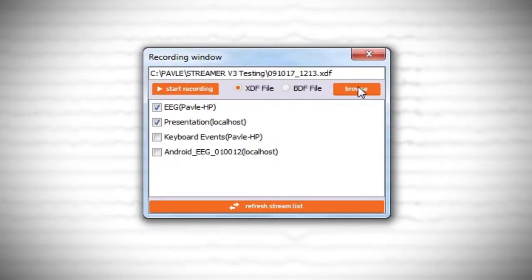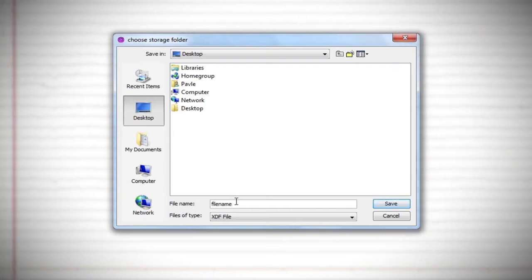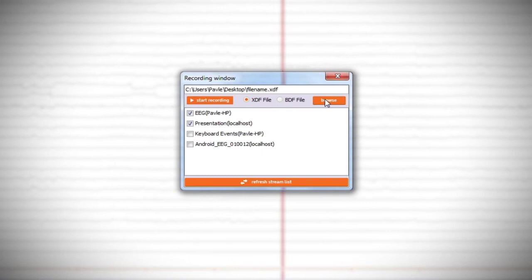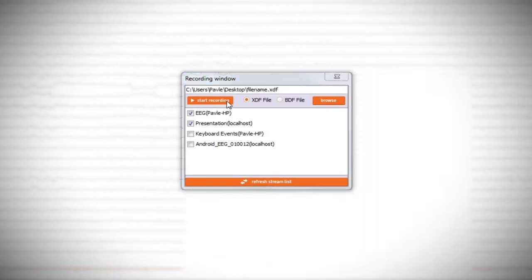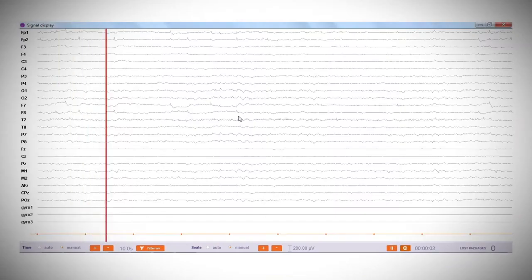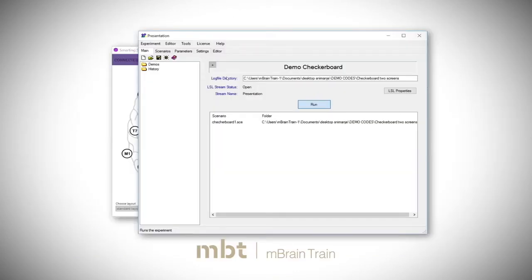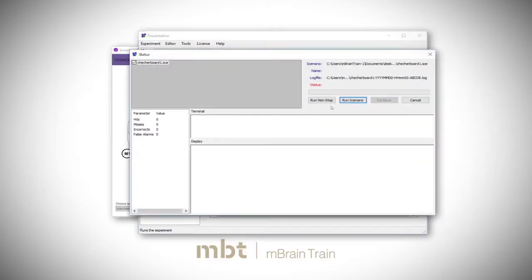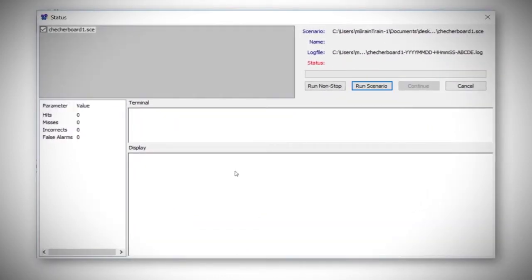Click the browse button to navigate to the folder where you want to store the data, and provide the desired file name. When everything is set, click start recording button. Go back to the presentation window and click on Run, and then the Run Scenario button to start the experiment.